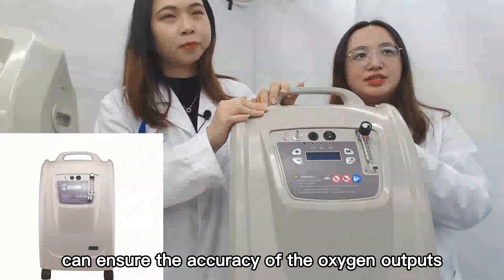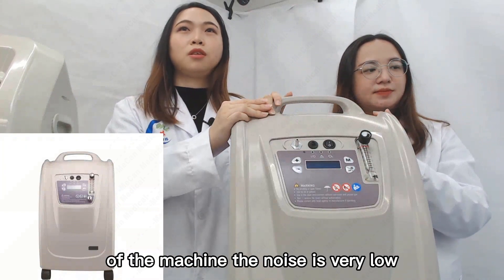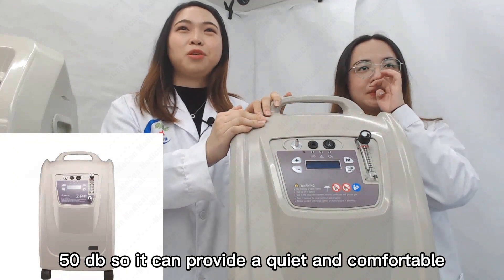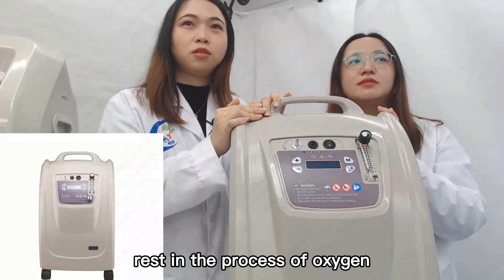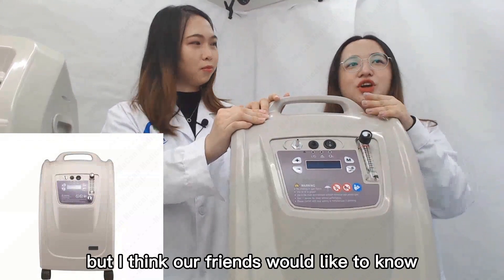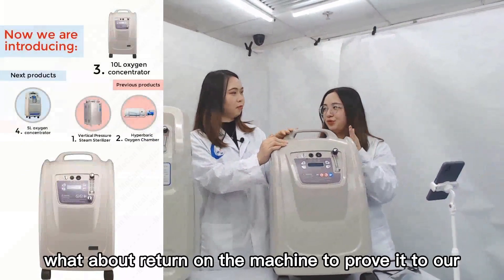These additional alarms can ensure the accuracy of the oxygen output. During the operation of the machine, the noise is very low — the sound will be lower than 50 dB — so it can provide a quiet and comfortable environment for the user, allowing the user to have a better rest during oxygen inhalation. Our friends would like to know if the sound is really low during operation, so let's turn on the machine to prove it.